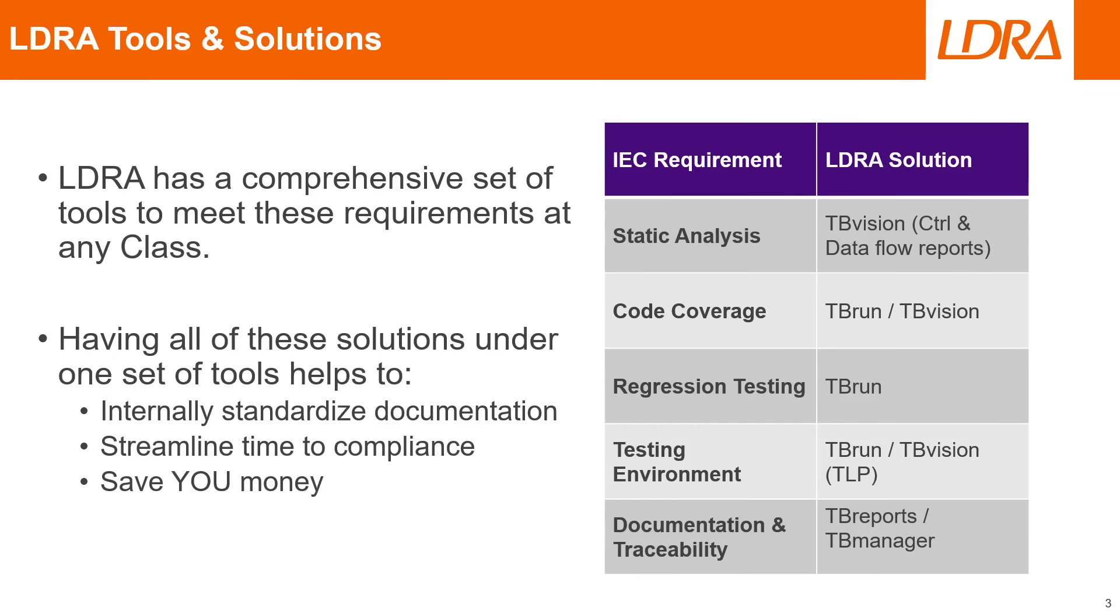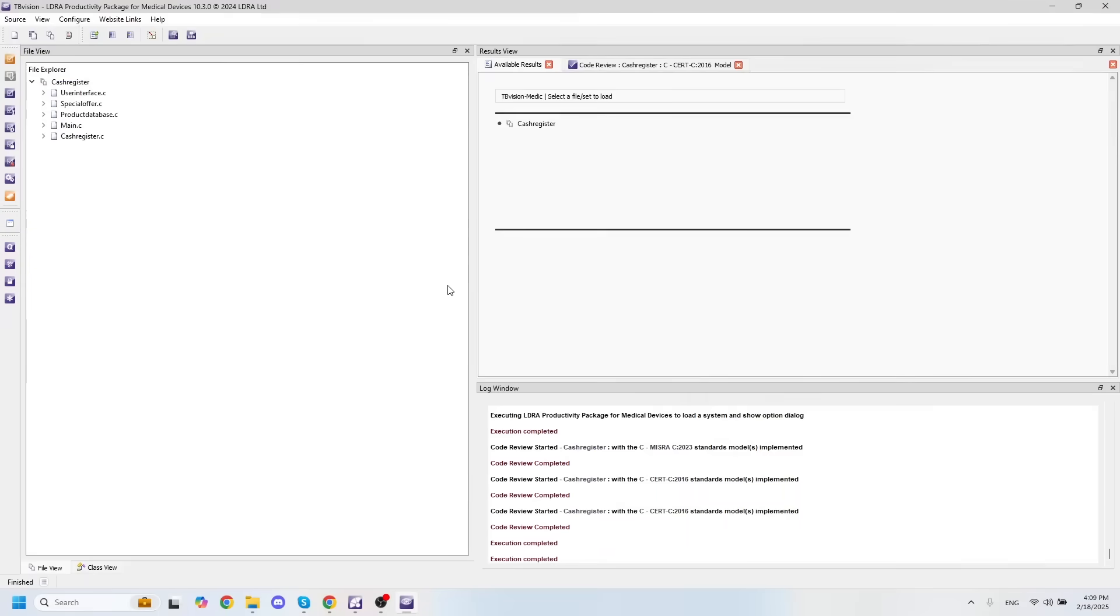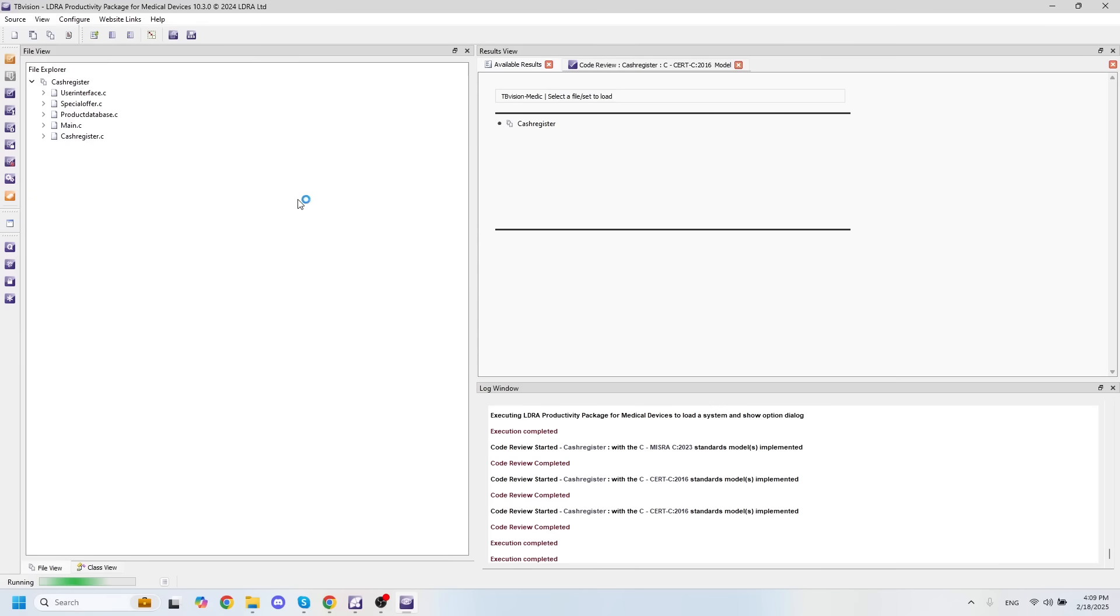So let's jump right into the LDRA productivity package for the medical industry and take a look at how this works. After bringing your code into the LDRA productivity package for medical devices, one of the first things you'll want to do is to configure your coding standard for static analysis.